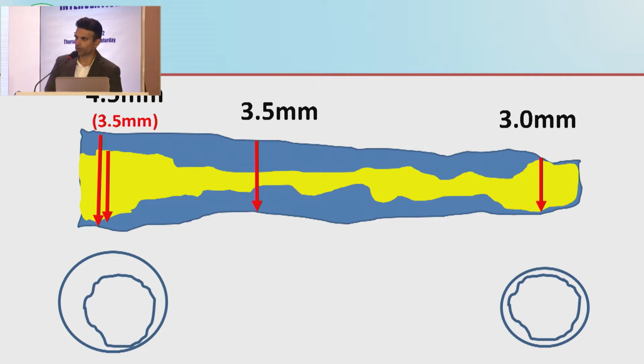We talked a little bit about it in the other room yesterday and today, which was about how to handle calcium, for example, and using what tool. Your distal edge is 3 millimeters, right, from EEL to EEL. Your lesion length is 30 millimeters. Your reference vessel landing zone is where your problem is. Because do you see proximally here, is this a healthy landing zone? Not so much, right? There's more than 30% plaque here.